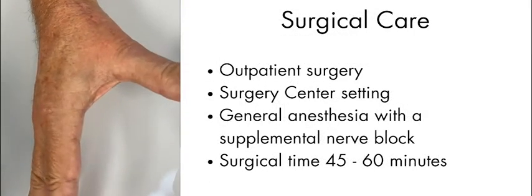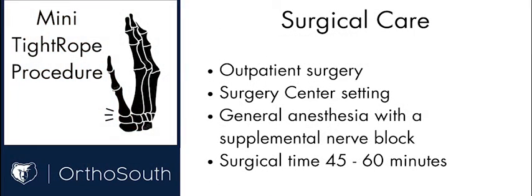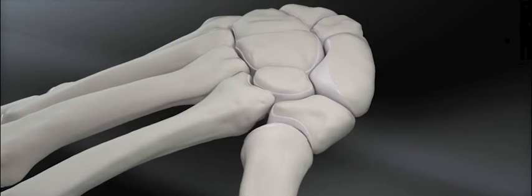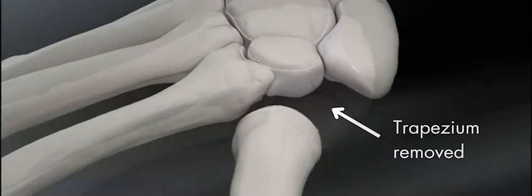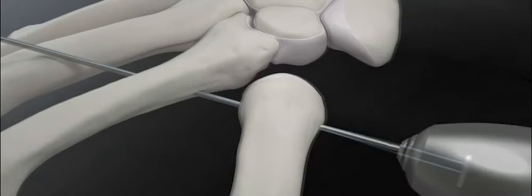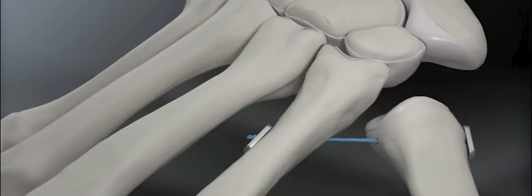The surgery is done as an outpatient procedure in a surgery center setting. We typically use general anesthesia with a supplemental nerve block. Surgical time ranges from 45 to 60 minutes. The procedure is done through 2 separate small incisions. A 1 1/4 inch incision over the top of the thumb gives access for removal of the trapezium. A second small incision allows the implant to be connected to the index finger metacarpal and properly tensioned and tied.